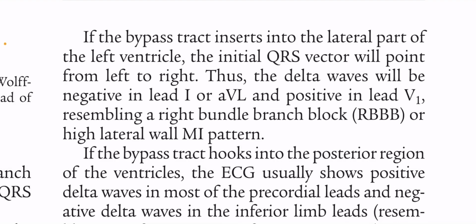Resembling a right bundle branch block or high lateral wall MI pattern.